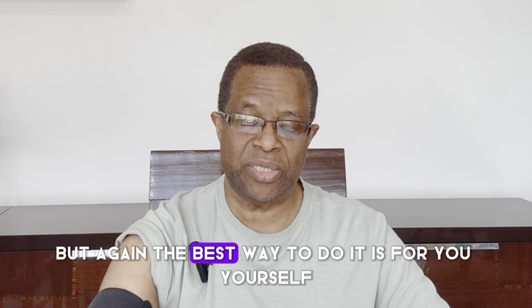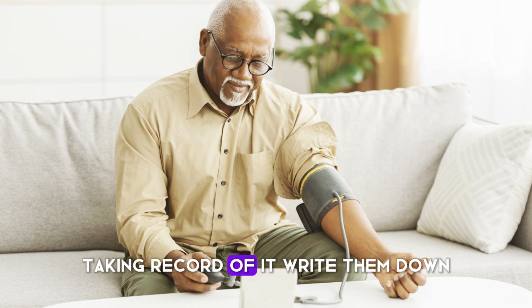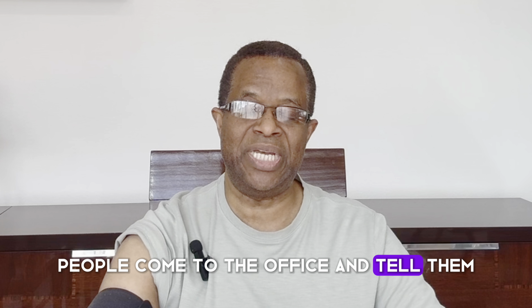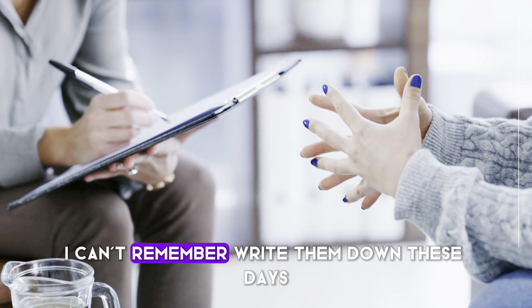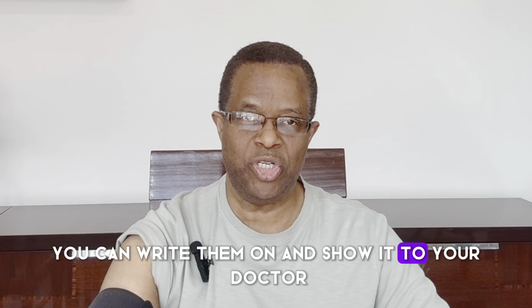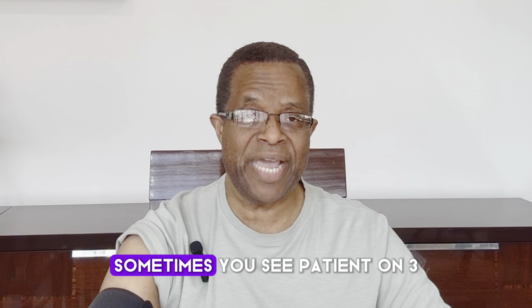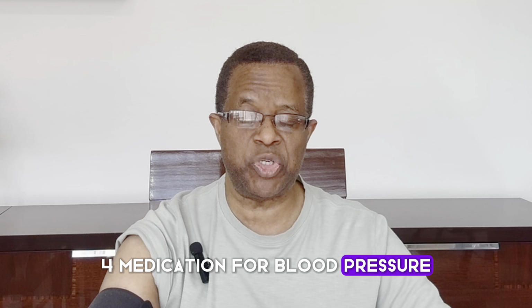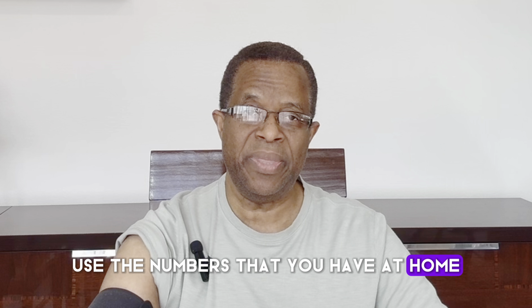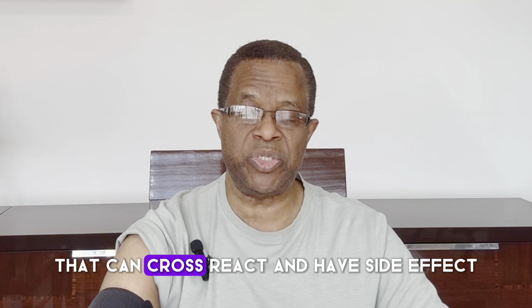But again, the best way to do it is for you yourself to take your blood pressure and keep a record of it. Make sure you write them down, because sometimes people come to the office and they ask, what's your blood pressure? And they say, oh, I can't remember. Write them down. These days you have your iPad or whatever it is, you can write them on it and show it to your doctor, because this will help them give you the right medication. Because sometimes you see patients on 3, 4 medications for blood pressure because of the numbers that are seen in the doctor's office. Use the numbers that you have at home. They can adjust your medication so that you are not on several medications that can cross-react and have side effects.